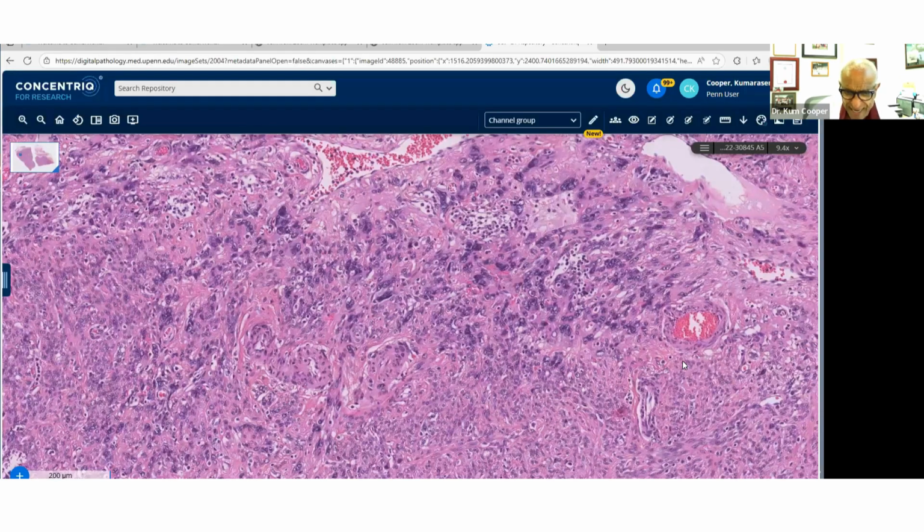If there is a hyalinizing granulation type of tissue between those two foci, spindle cells and the necrosis, then I use the word hyalinizing infarction. And I see that in leiomyomas, and I see that in leiomyosarcomas as well. So primarily, you've got to come back to your mitotic figures, necrosis, and atypia for that.